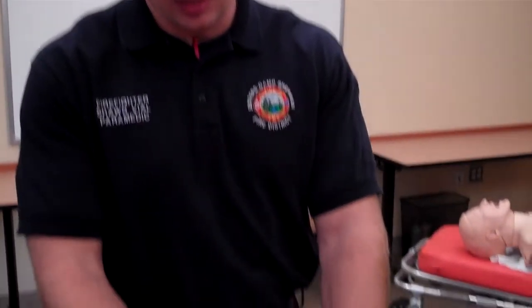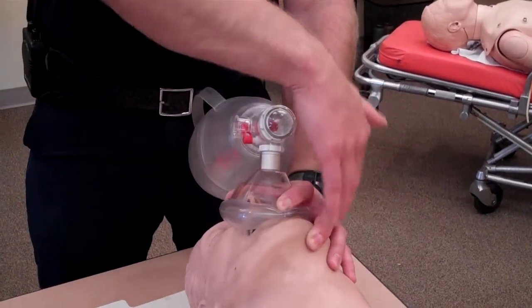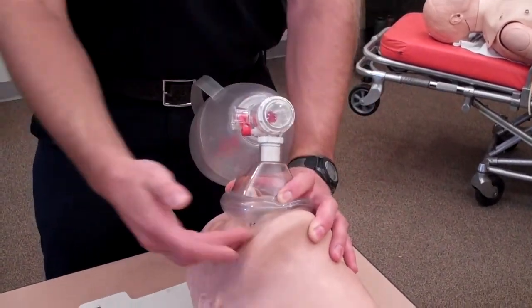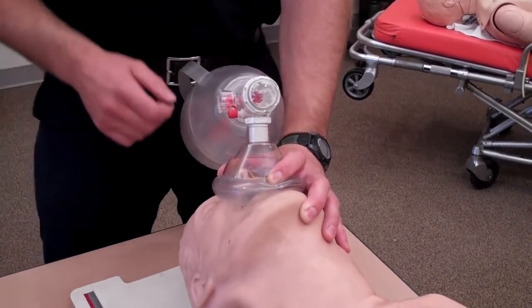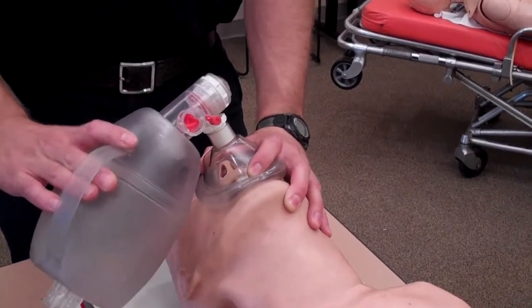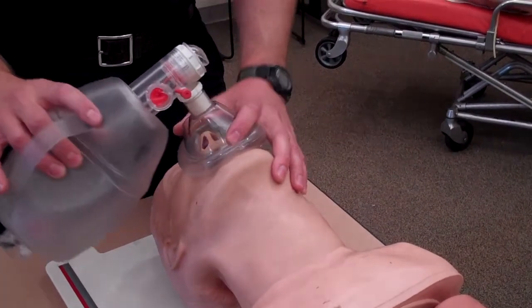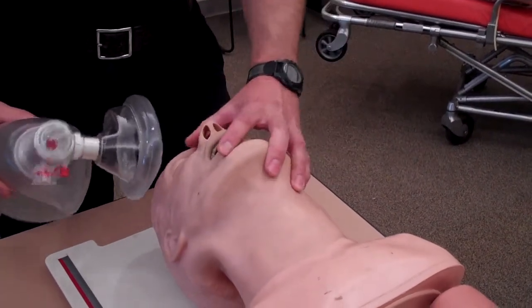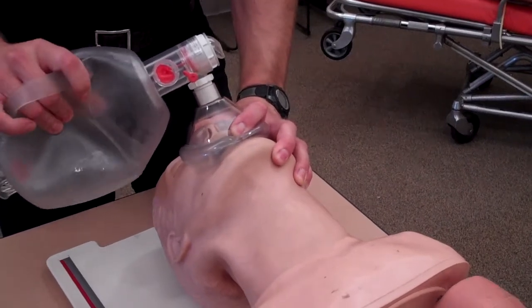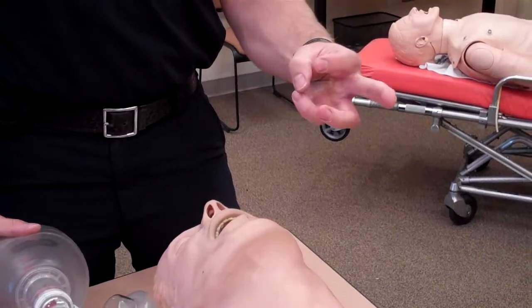The problem with the CE technique is that if you're having trouble getting a good seal, it's usually on one side of the face because all the pressure is over where the ventilator's hand is, so there's leaking on the other side of the patient's face. There are a couple of techniques for dealing with this. The most common is simply to lever down with the bag on that side, but then you get into a teeter-totter problem. The other issue is this is a really unnatural motion to maintain a seal with your hand.